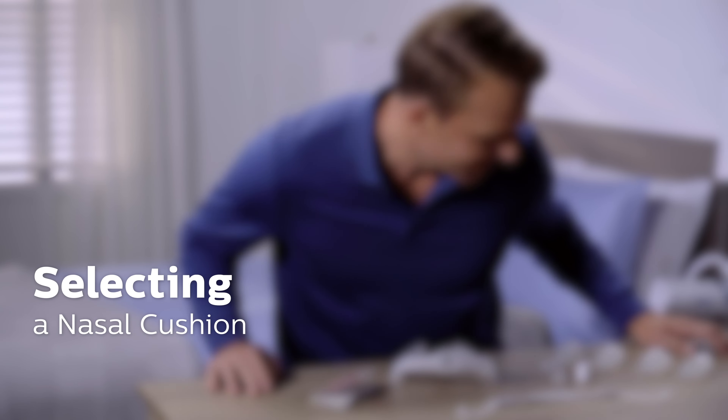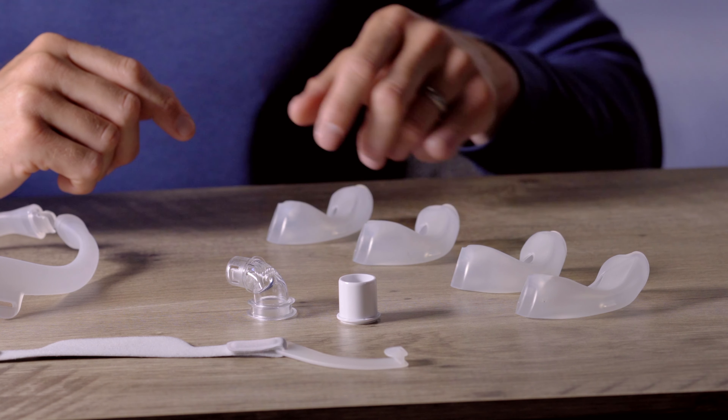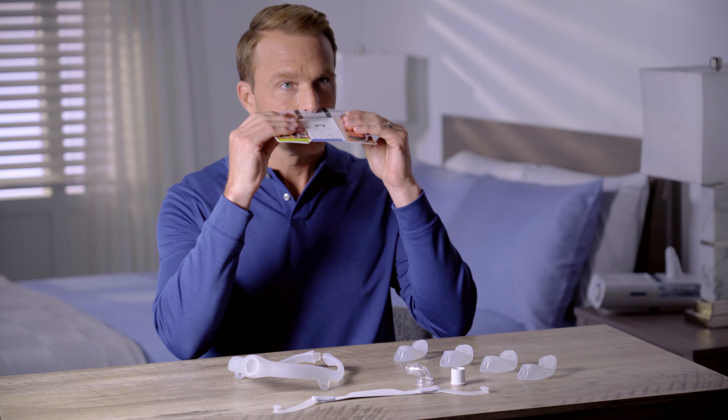Your Philips Dreamwear Mask can be used with nasal cushions. These cushions come in four sizes: small, medium, medium-wide, and large. You'll find a sizing gauge on the Quick Start Guide.